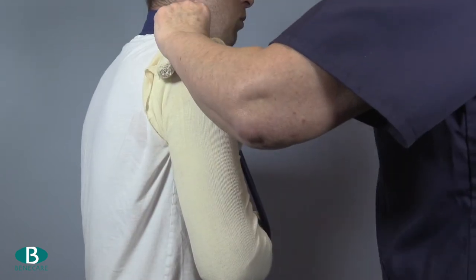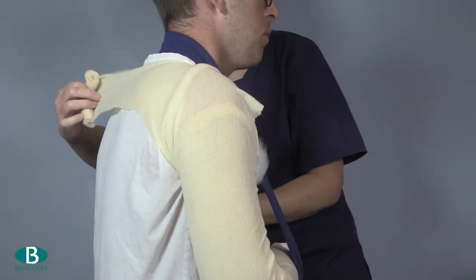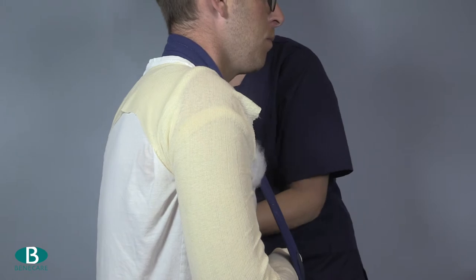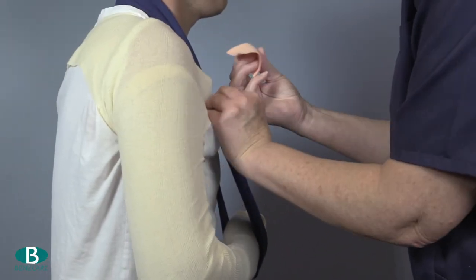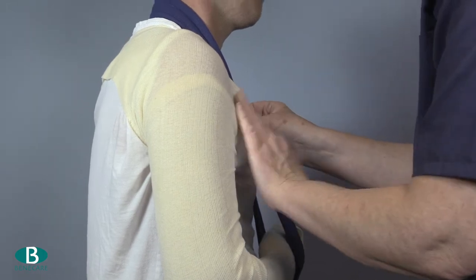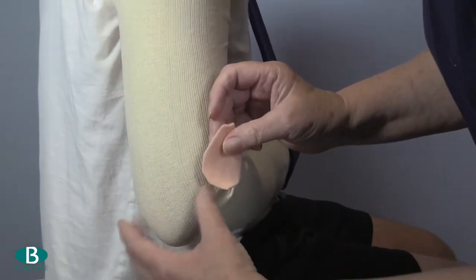Make a second cut in the centre of the roll at the nape of the neck and stretch the two pieces across the body and tie in the opposing axilla. Pull the stockinette across the shoulder and secure with tape. This will provide a smooth template for applying the brace.